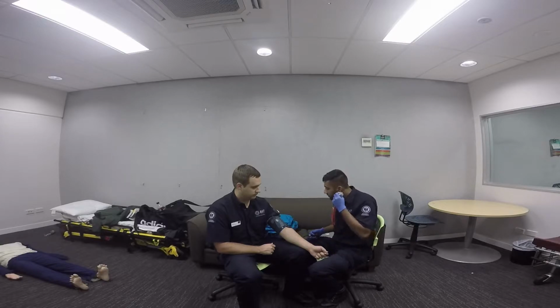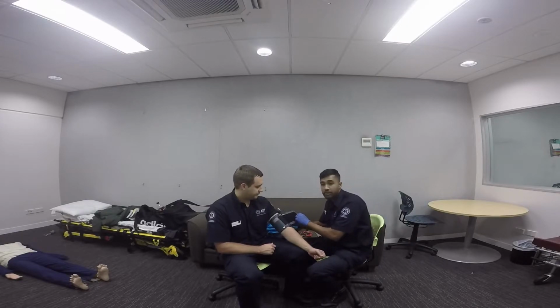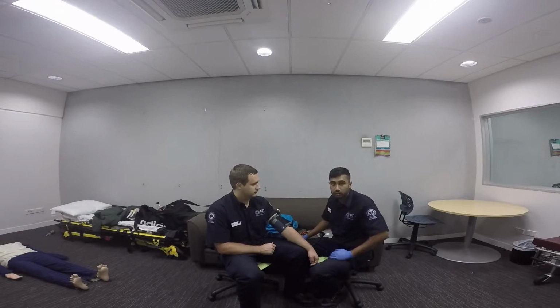Alright, what I got there, Martin, was about 130 over 90 millimeters of mercury, so that's a little bit higher than our normal range of 120 over 80. Typically, systolic over 140 or diastolic over 90 millimeters of mercury indicates hypertension.